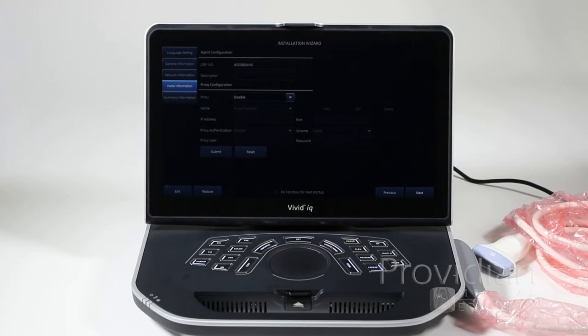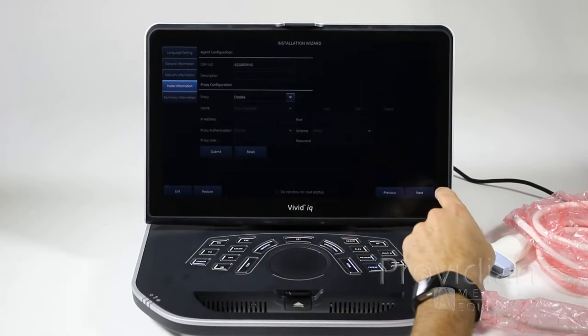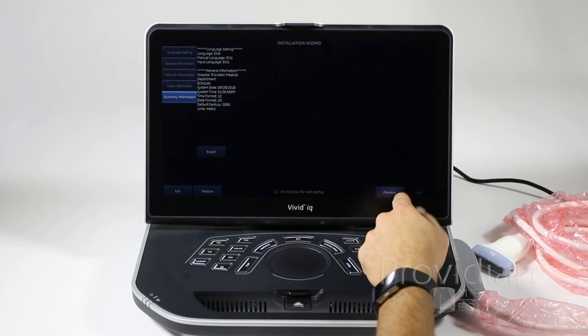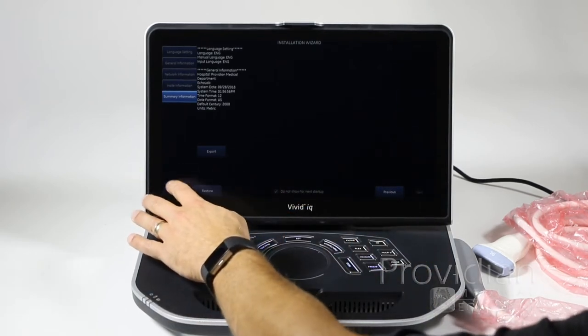I'm going to use the touchscreen and click next. There's more specific information here — if you don't know what it is, someone would tell you what you need. Then there's just a summary of what you've put in. If you want to export it to USB, go ahead. Then just click exit.